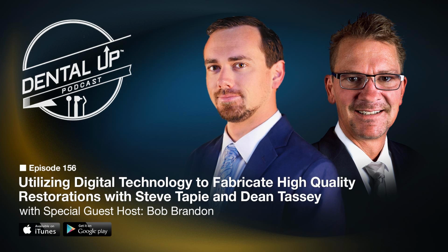It's also nice in cases where we're filling out the buccal corridor and creating a wider smile for a patient that's missing a tooth. We can cut back and add to buccal surfaces only, to where everything in function is going to be the zirconia and the core material.